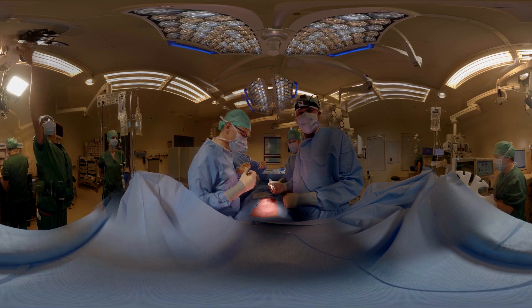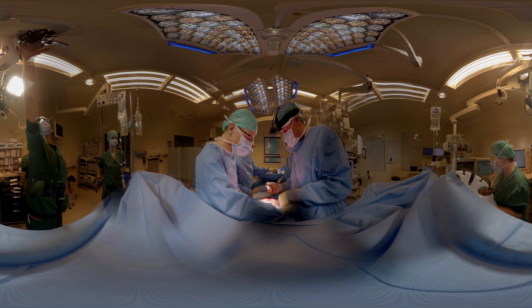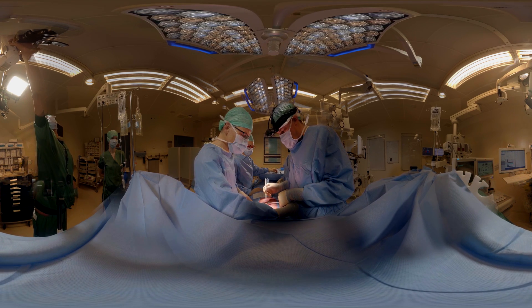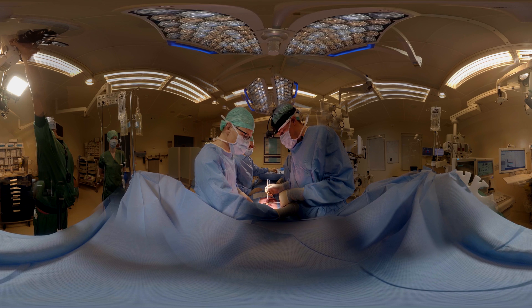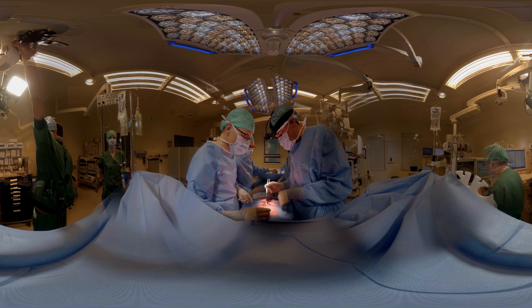The advantage of this mesh is that we can go straight down directly into the abdominal cavity and position the mesh over there, instead of having to preserve the peritoneum.